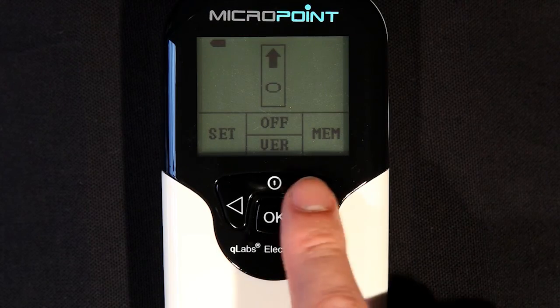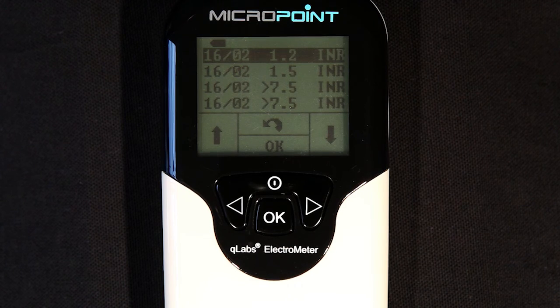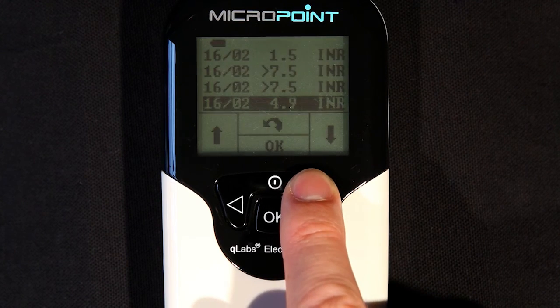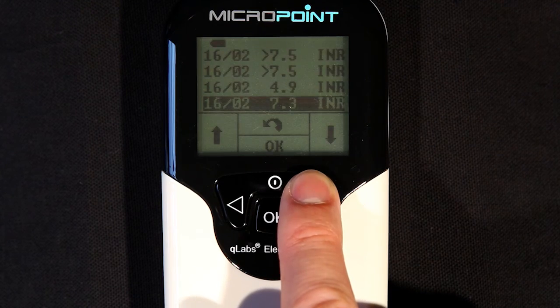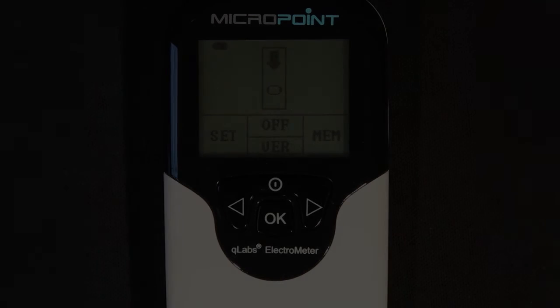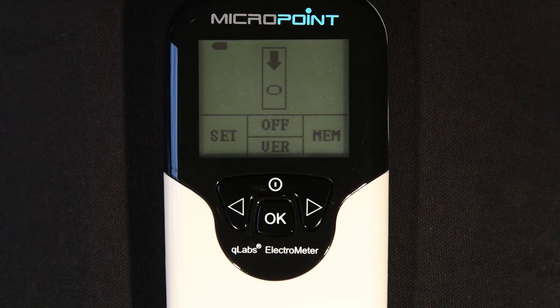Test results are automatically stored in the Q-Labs Electrometer memory. The unit can store up to 200 results, and if the memory is full, the new test result will overwrite the oldest test. When data has been acquired, press the OK button. The meter will prompt the user to remove the test strip and will be ready for the next test.